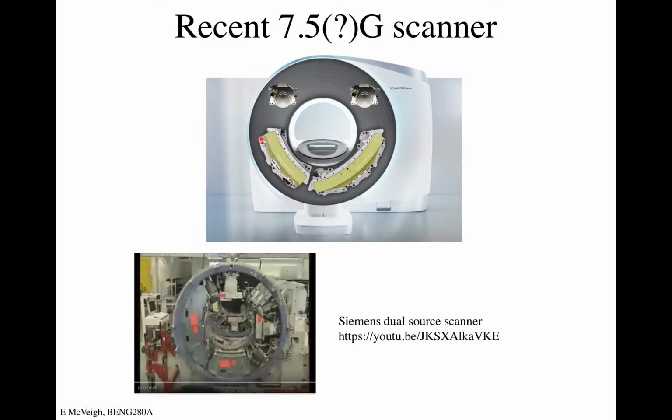And so you're basically simultaneously doing these orthogonal shots, which just increases the number of angles you're getting for each rotation, right? So you basically can get a CT scan in half a rotation because you've got these extra detectors. So it speeds up the process of getting all of the data you need in the theta direction, in the rotation direction.